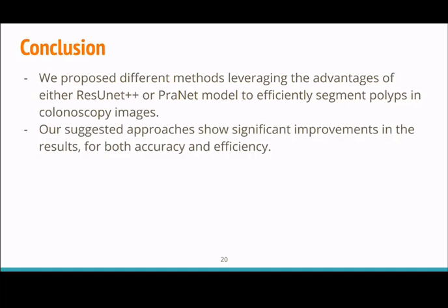To sum up, the polyps segmentation task suffers from weak boundary problem, varied polyps shapes and size problem, and the unequal distribution of the hard versus easy cases between training and testing dataset. We propose 2 models based on either PraNet or ResUnet++. Each tackles the problems differently. The first, the PraNet-based one, used signal annealing and high boost filtering.